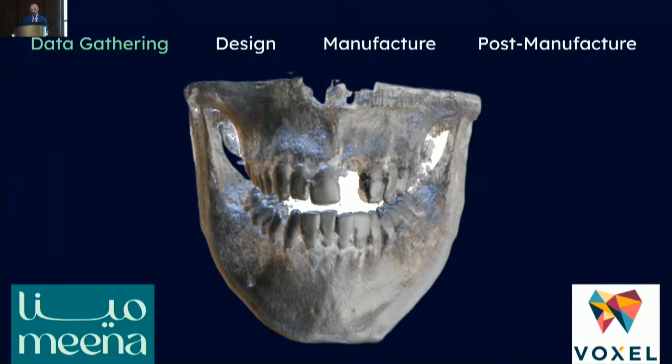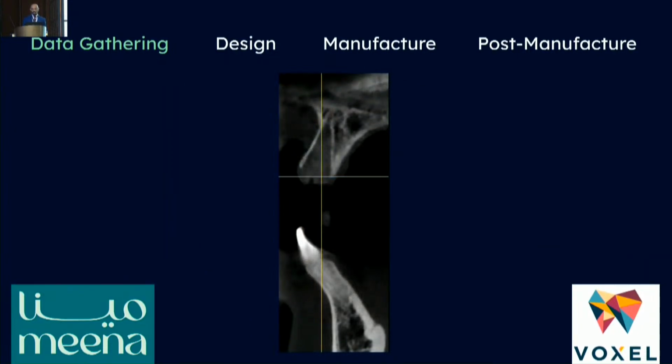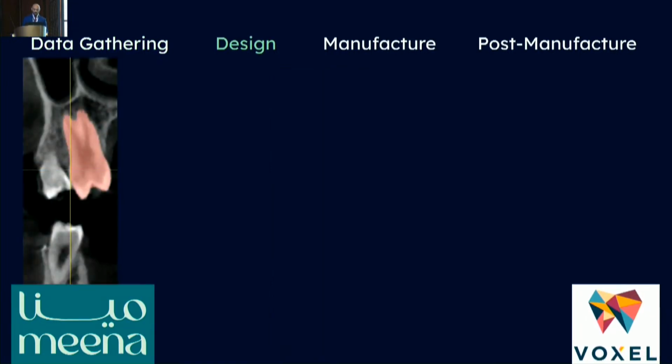Because the only thing used in this case is to digitize the patient with a CBCT scan for hard tissue purposes. We can examine this site of the avulsed tooth and the state of the buccal and palatal plates, as well as the upper left 5 planned for transplantation. With today's technology, artificial intelligence can be utilized to automatically segment any tooth of our choosing to be able to create a model replica of it.